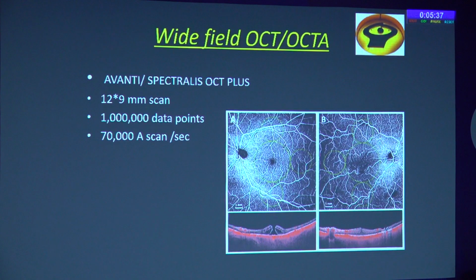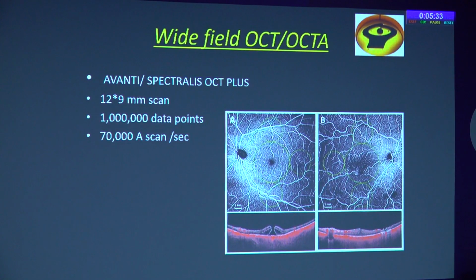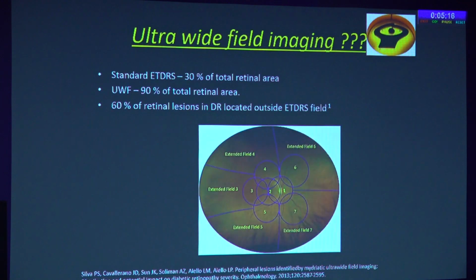But then came the wide field OCT or OCTA, which was able to cover a 12 x 9 mm scan, in the name of Avanti or Spectralis OCT Plus, which can cover up to 10 lakh data points at the rate of 70,000 A-scans per second. But still, we need ultra wide field imaging because we know the standard ETDRS can cover only 30% of the total retina, and most of the retinal lesions can be located outside the ETDRS field.